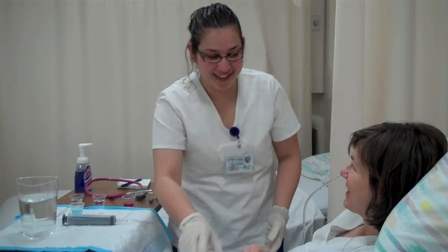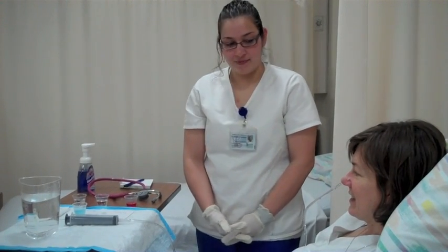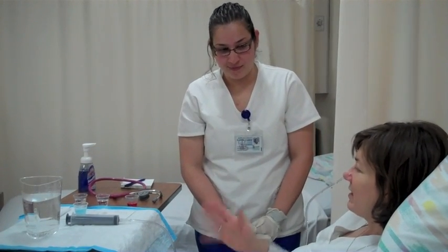Okay, thank you, Fergie. Inform the patient of the medications they will be receiving and ask if they have any questions or concerns. Today I'm going to be giving you your Tylenol, Ativan, and Simvastatin. Do you have any questions about them? No, I take those all the time.